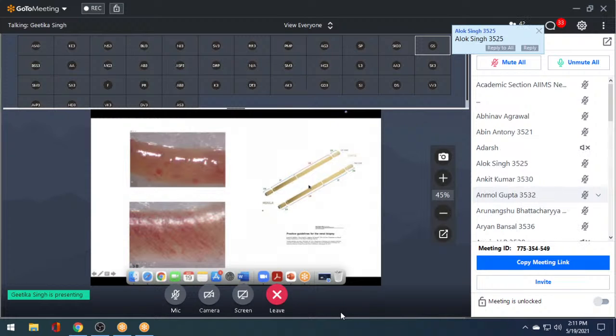And why does it need these 2 things? It's very important that you need the IF and the EM, because like I told you, I can't see immune complexes or the type of immune complexes on LM. I can only see the pattern of glomerular injury. So when I want to decide, are there immune complexes there? If they are, what are the types of immune complexes? Are they capillary wall depositions? Are they mesangial depositions? This is how the IF and the EM come in and become absolutely imperative to reach a diagnosis, especially when you're dealing with immune complex mediated proliferative glomerulonephritis.